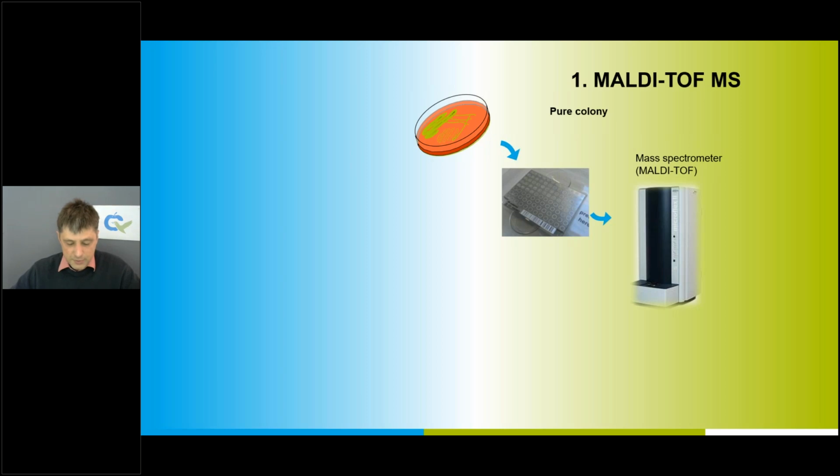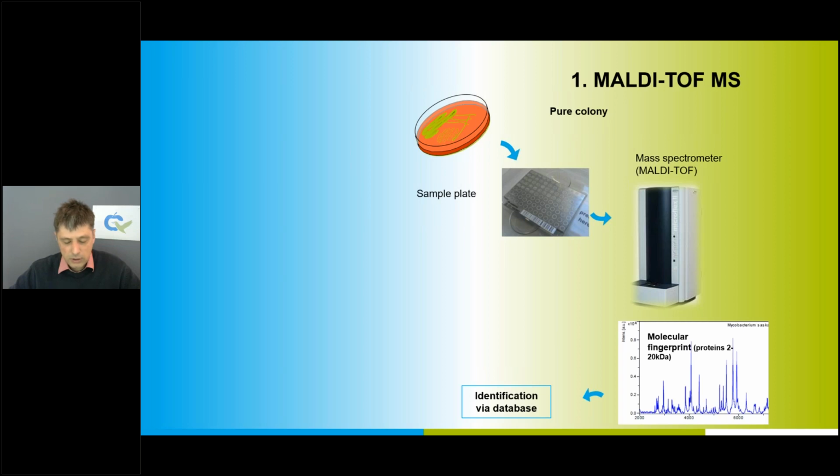For microbes, we use a workflow from MALDI-TOF mass spectrometry to infrared spectroscopy. The MALDI-TOF MS process is common, as shown by Belen in the first talk of today. Bacteria are extracted or smeared directly on a steel plate, overlaid by matrix to obtain a molecular protein fingerprint in the mass spectra.